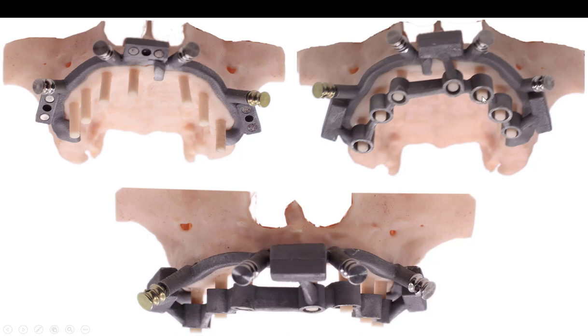So this is the drill guide. This is all going to be printed in chrome cobalt. And there you see it from the anterior. Here it is all printed — Oral Arts Laboratory in Huntsville, Alabama did the metal printing for me. I printed the models on my SprintRay and test fit everything. It looks great. These are printed abutments for where the implants should end up, and as you can see, the guide is right in the center of that hole.